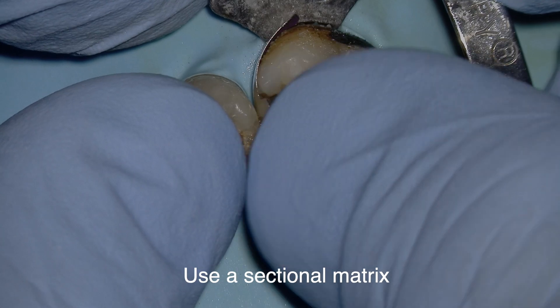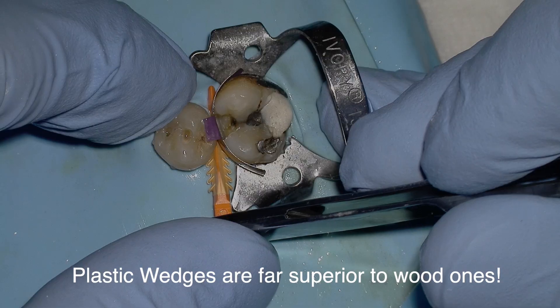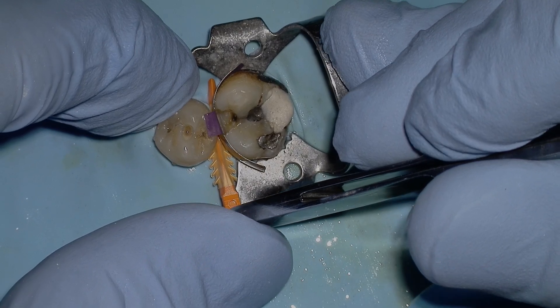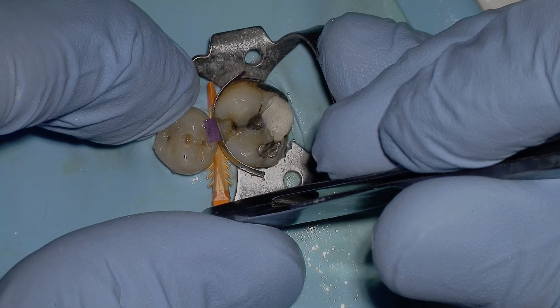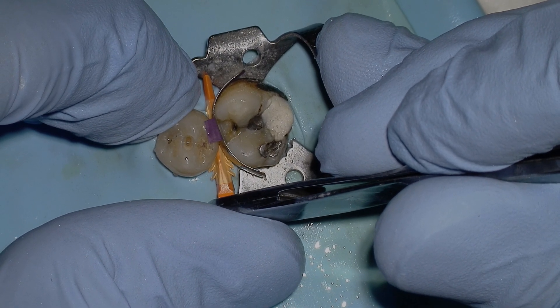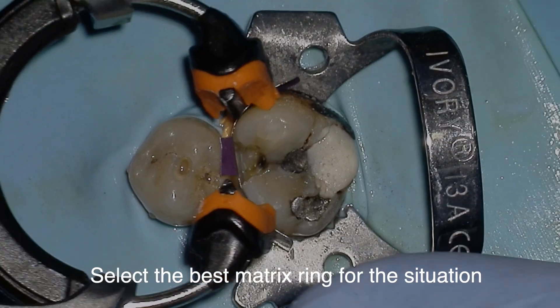Tip number eight: use a sectional matrix — find one that fits. These are absolutely incredible for making an unbelievable contour and contact. Tip number nine: try these plastic wedges — Garrison makes them, Palodent makes them. They are far superior to wood ones: they don't break, they just bend. Once placed, they stay in and don't fall out — absolutely amazing for getting a beautiful contact.